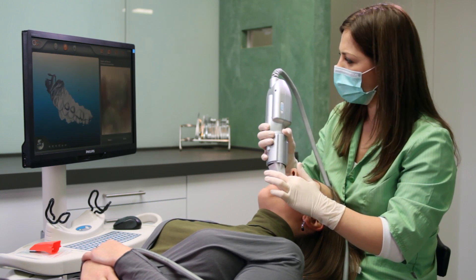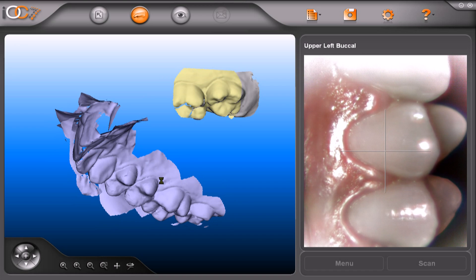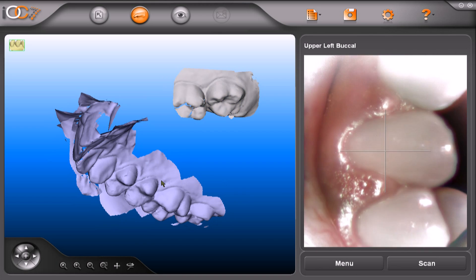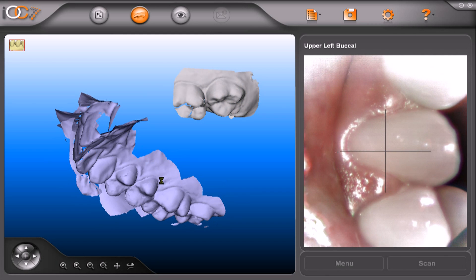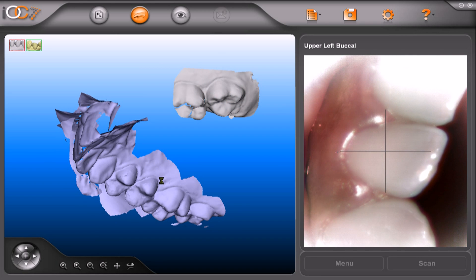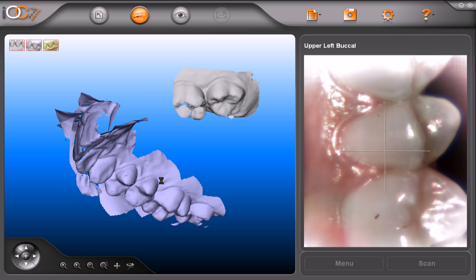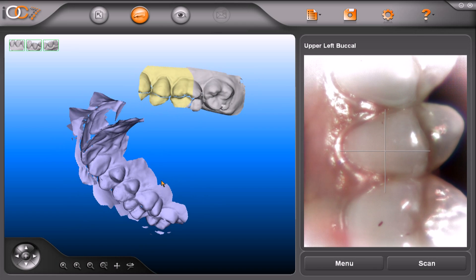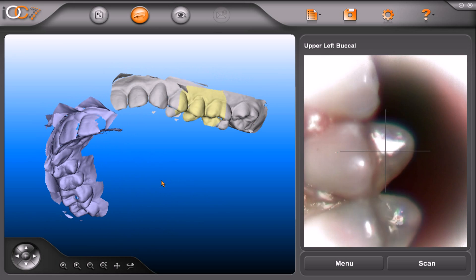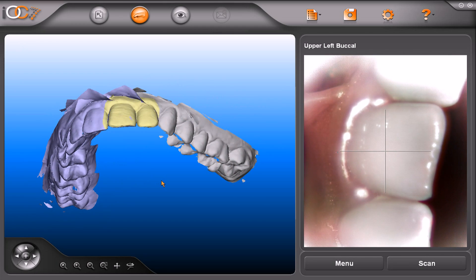If you break sequence, which means moving too far where there is no overlap between scans, you will notice that the last scan will remain in the upper left hand corner with a little red border. This means that you need to take an additional scan to piece the scan to the rest of the arch. To fix this, look at the area that you have captured so far, get part of that area in the field of view, and make sure it coordinates with the scan that didn't fit. Then the system will automatically stitch those pieces together.